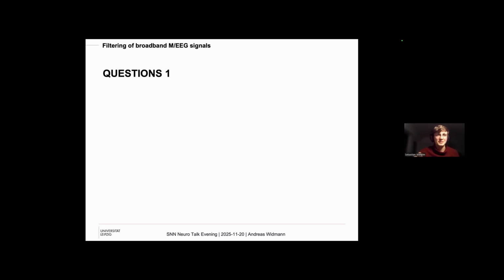I know your talk today has been mostly about ERP, and therefore not that much regarding real oscillations, if you use a steady state response, for example. But I had a very short talk with Professor Andersen, whom I've worked for in Denmark, and we discussed filtering, and we basically agreed on not filtering at all when using the steady state response. I think that's quite appropriate, because until now it is quite hard, or basically impossible from what I know, to separate an ongoing EEG oscillation, like the alpha band, from a stimulus-driven oscillation. Is there anything that you know that is currently being worked on to help with that kind of issue? I don't know how much of a difference it makes in terms of the data in the end, but it is something you could take care of, right?